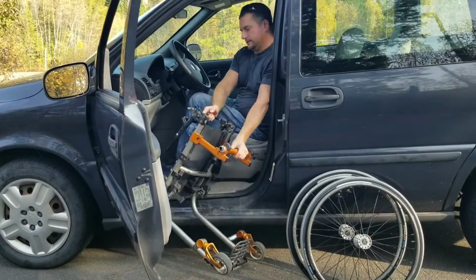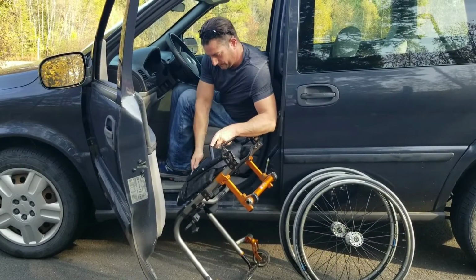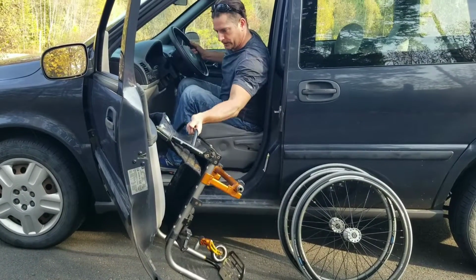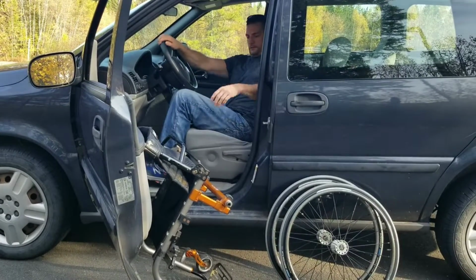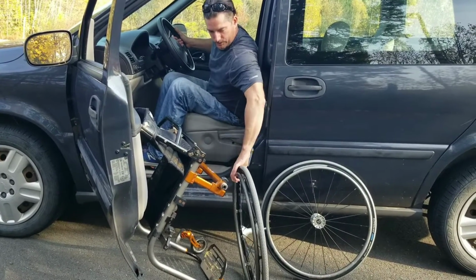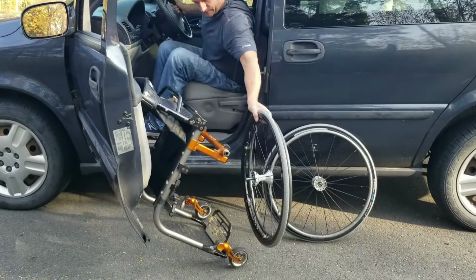Back out like this. So that's like that. Now my upholstery came off. I fixed my upholstery. There we go. So again, I'm going to lean the chair up against the car like that. And then I'm going to take a wheel. Now I do have directional tires on, so I got to be careful which tire I put on which side. So this one here is going to go on this side.